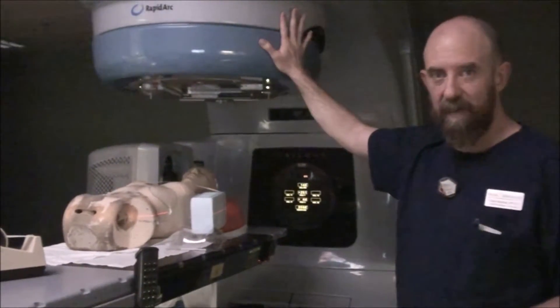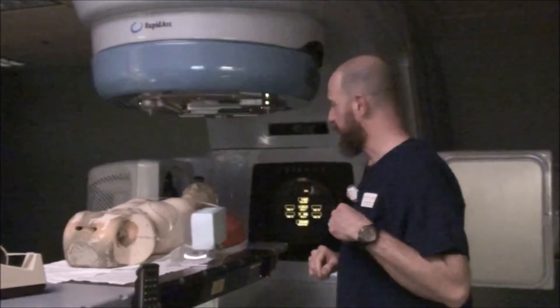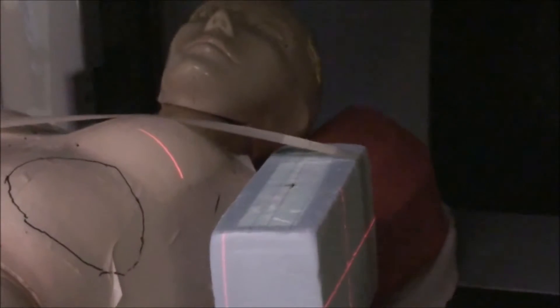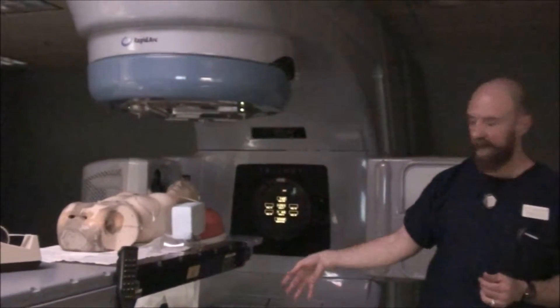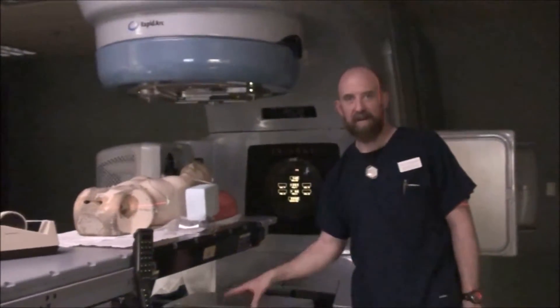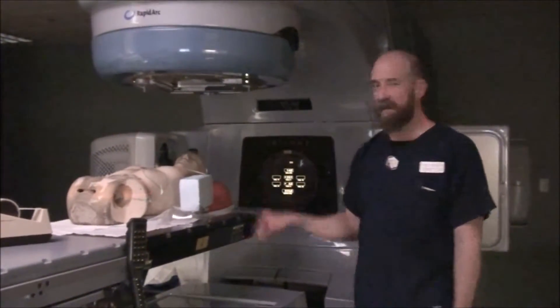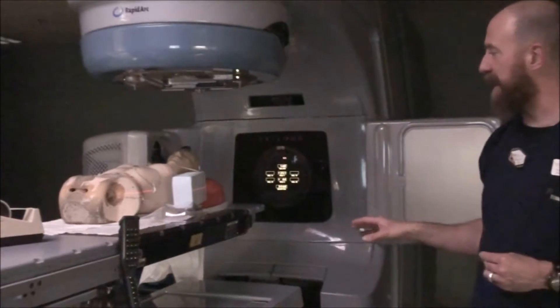Once you have all of that documented, come inside. Immediately go ahead and mark the CR on the patient before they have a chance to move. If your doctor moved in, out, or left-right, double-check your SSD and make sure it's exactly what you expected. Once you have that set, the next thing you want to do is take your film. Set your image intensifier, center the II, set your TFD, put your marker on, put your film in, take your x-ray.